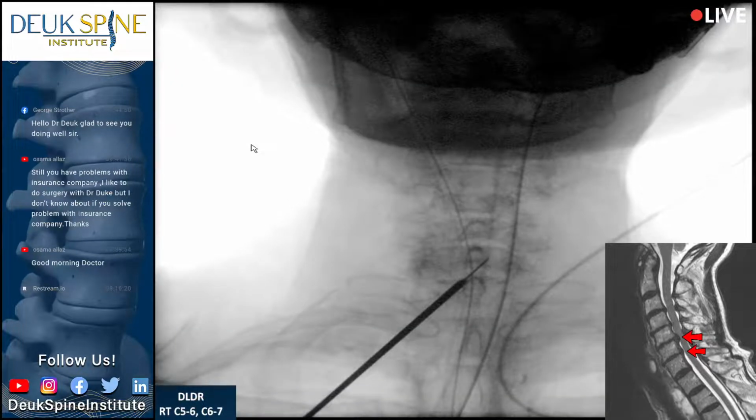And if you look there, show them, stay there, and show them the spinous process. You don't have to take another shot. Just go show them. We're going to use the white arrow. Flynn, you should be on that AP X-ray. There's a spinous process. Circle it with the arrow. Perfect. Now show the one below. Now draw a line between the middle of the two spinous processes. That's dead center where she's showing you. To the middle. There you go.